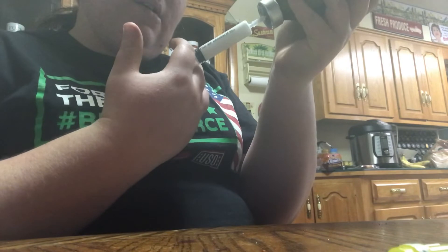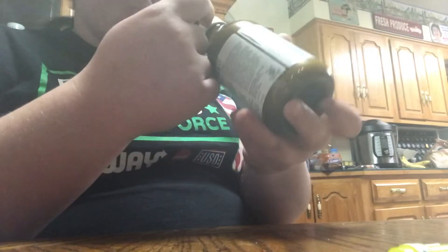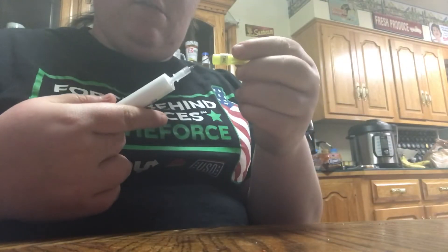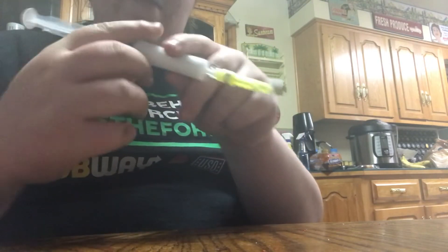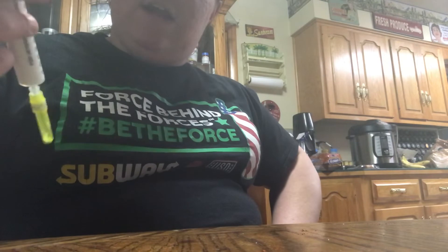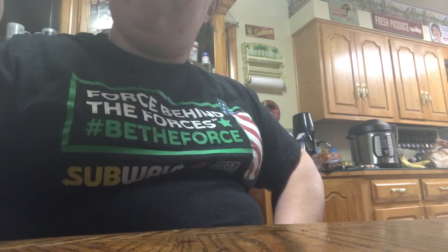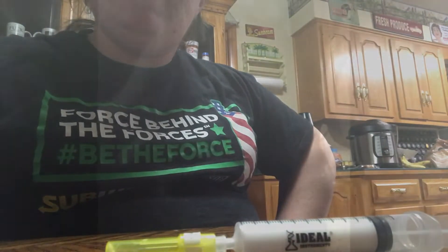I'm going to go ahead and make sure it's not going to go anywhere, and then I'm going to cap my needle. This way, when I make my journey from my home to my barn, this does not end up poking me or losing any of the medication inside. There is an air bubble — I can see it already — and I will show you how to get the air bubble out.